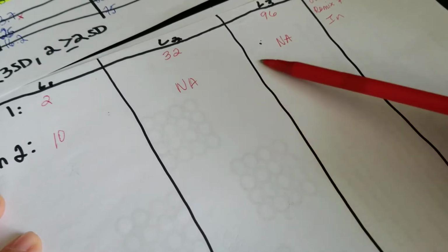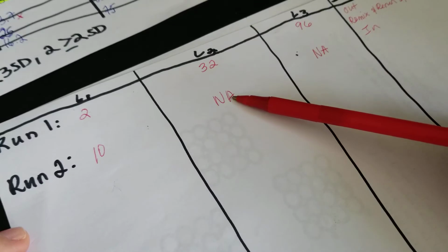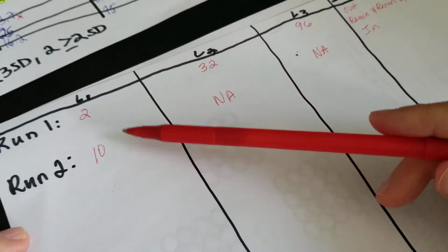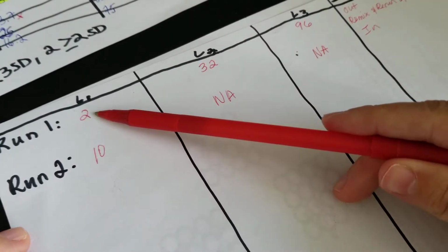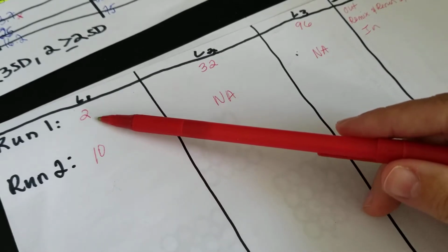Okay, I put NA here because you always need to provide an answer to make sure that your professor knows that you didn't skip it. So in the LIS, you would have accepted this one. You would have accepted this one too, but then done the troubleshooting skills.